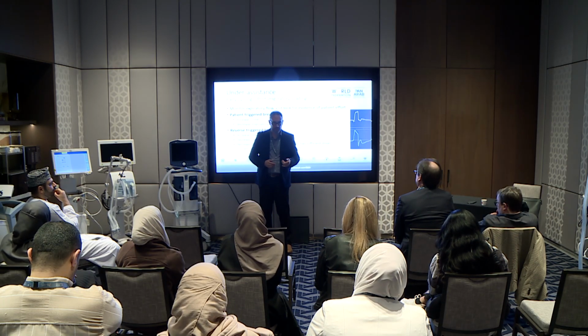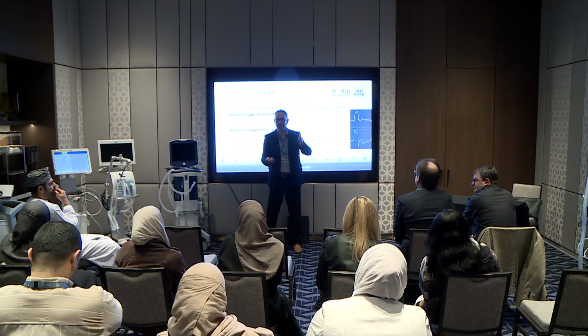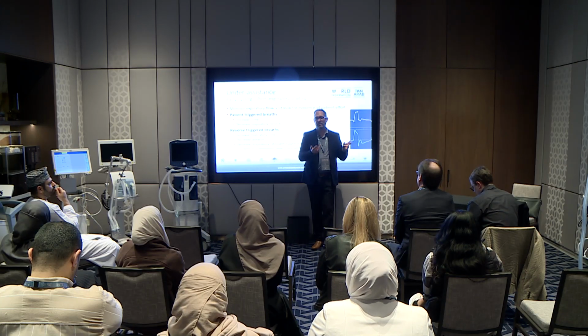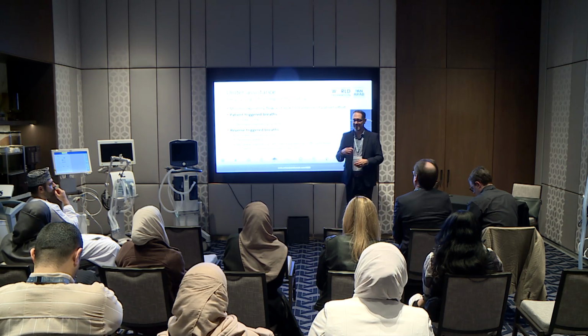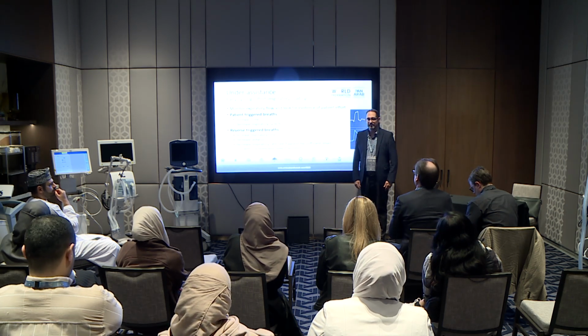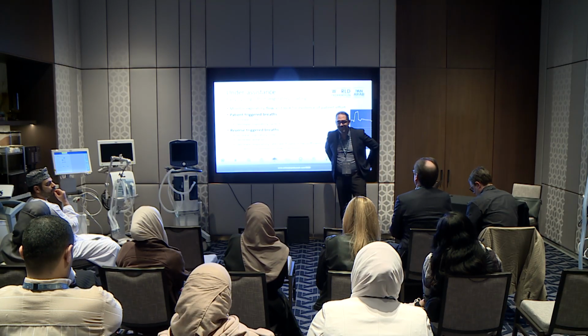So, what can also happen if I reduce it to 10? They may take over now, and now they're breathing at 14 or 16 breaths per minute, but they're triggering every breath. And now there's no longer reverse triggering, because the stimulus is not there, they're now taking over. And so in some patients it works, and in some patients they will just be breathing 10 and you're like, that's not good enough. What if they are breathing higher than 10? If they're breathing higher than 10, that's fine. Try pressure support.